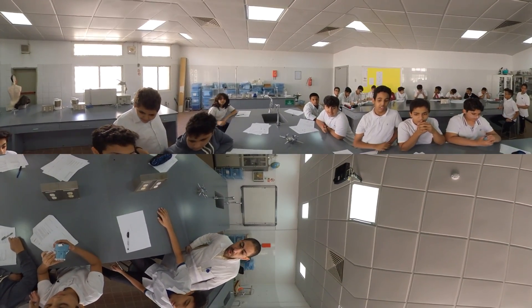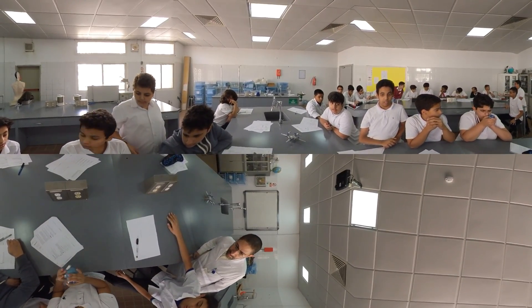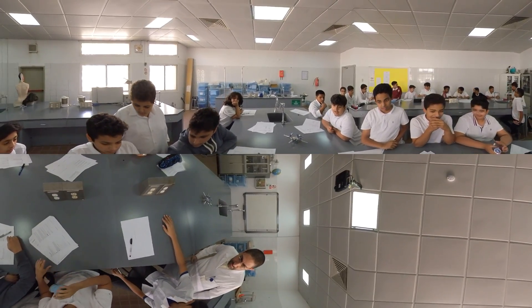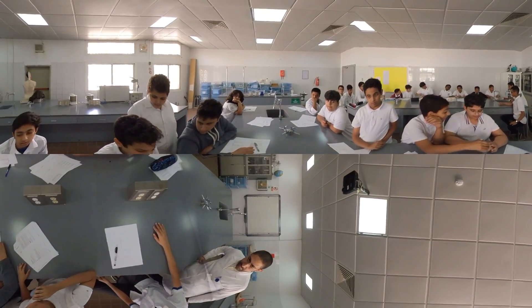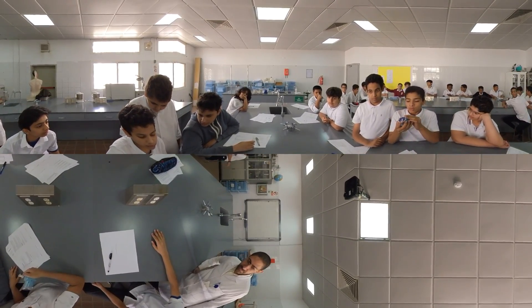Now, what are your measurements? This group — leader, what's your reading? 2,000. And the second one? 1,700 and 5,700.